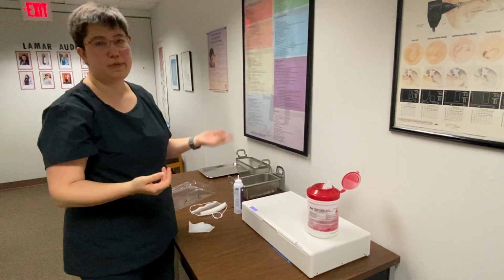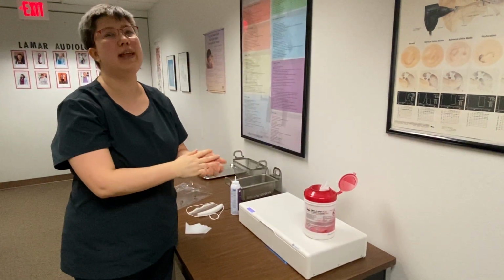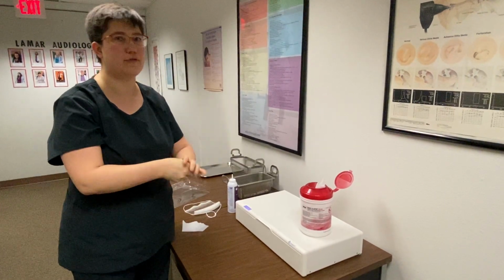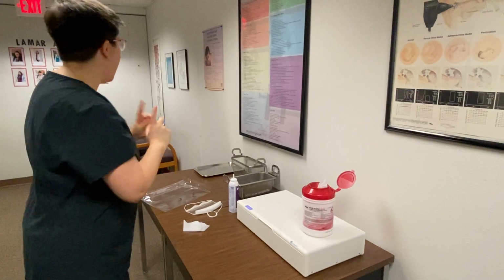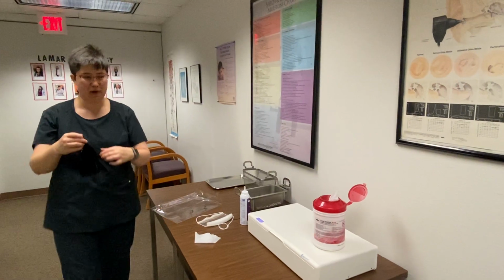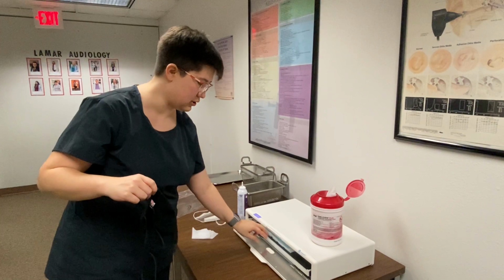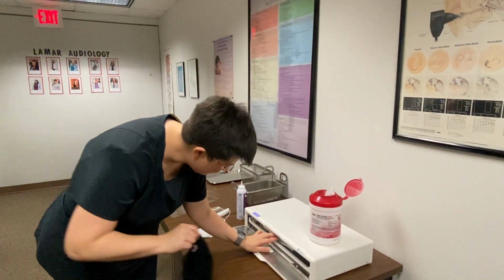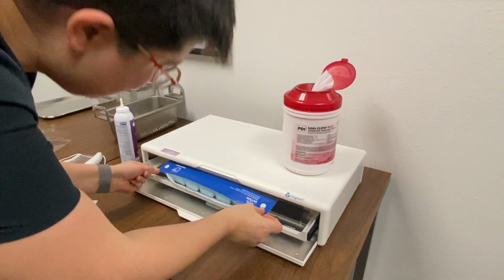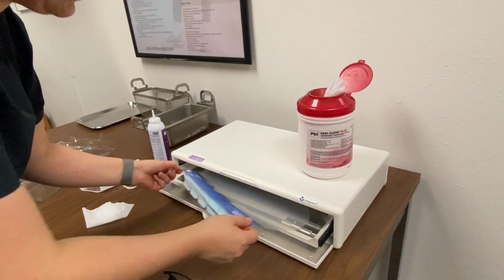So those are the things that we're probably going to prefer in clinic. The paper masks, we have one a clinic day. If you want to dry it out and sanitize it on your lunch break, feel free. The other thing, if you are up here working on things and you have your fabric mask, you can use this to do a fabric mask as well. Let me point out the awkwardness of this. See how it closed? That's why you want this one at the front and not the back, because you need to be able to straighten it out.